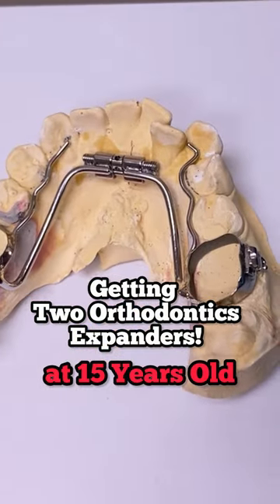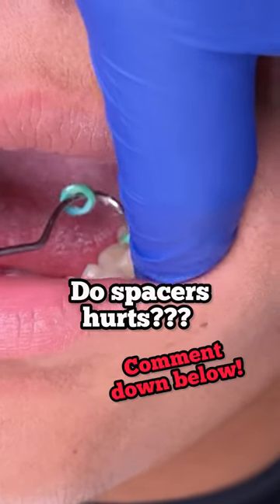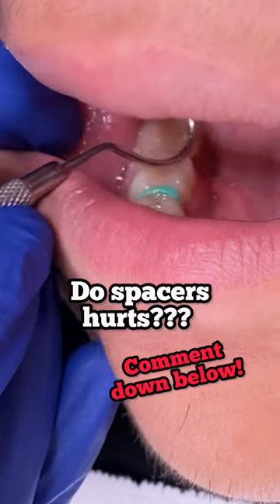Hey everyone, this is Abby, your hygienist here at 210 Family Dentistry. We're going to go ahead and show you how to deliver some appliances today, but first let's go ahead and remove these spacers that cause space to seat the appliances directly into the position of the molar.